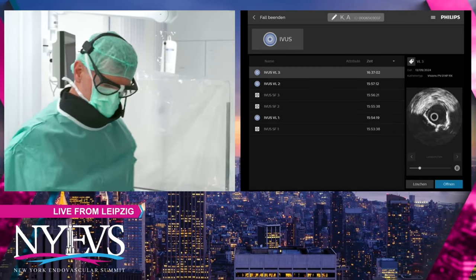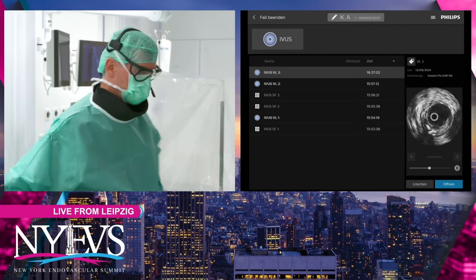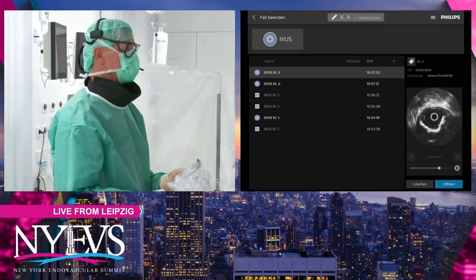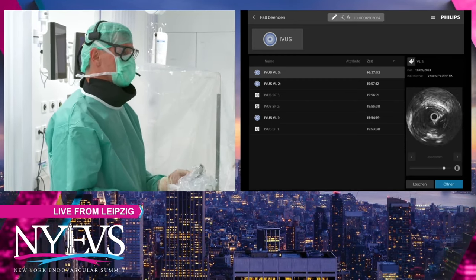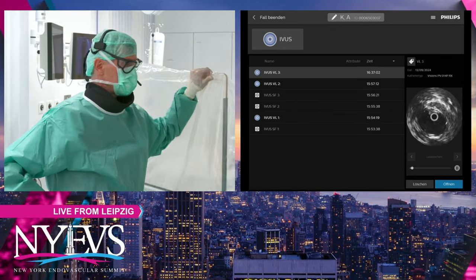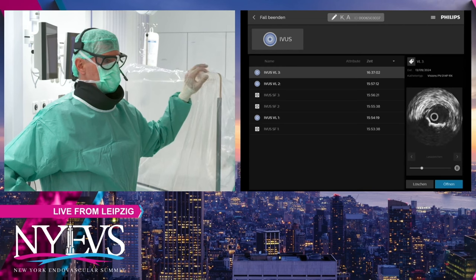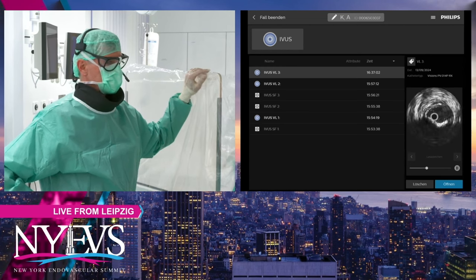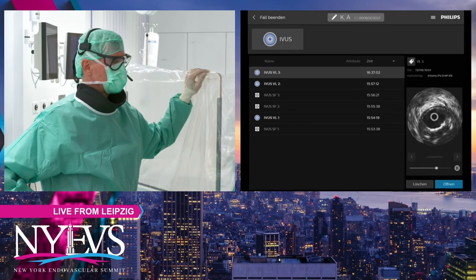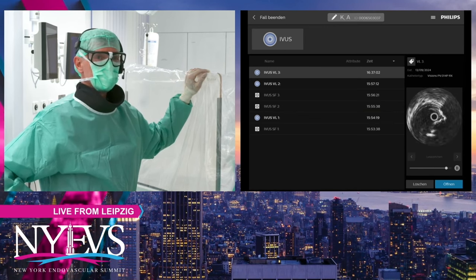And then what's your plan for follow-up at this point, Andre? And in terms of medical management, because we talk a lot about low-dose rivaroxaban, low-dose aspirin, dual antiplatelet, et cetera, what is your regimen in this case? In fact, after every procedure we do dual antiplatelet therapy for a month at least. I don't think he needs rivaroxaban additionally. I think there's a very low risk of acute thrombosis. I would just leave him on dual antiplatelet therapy.